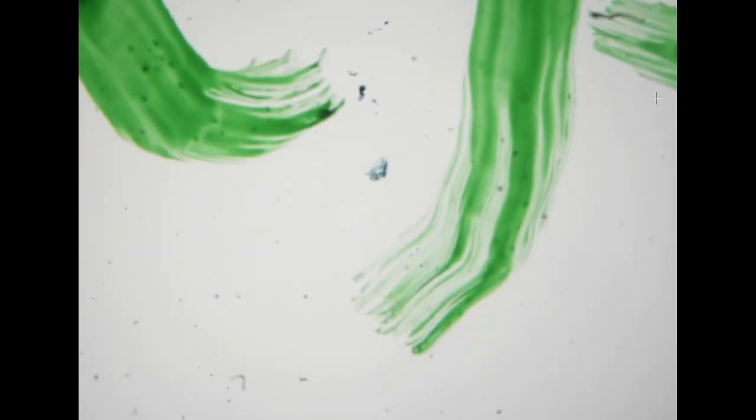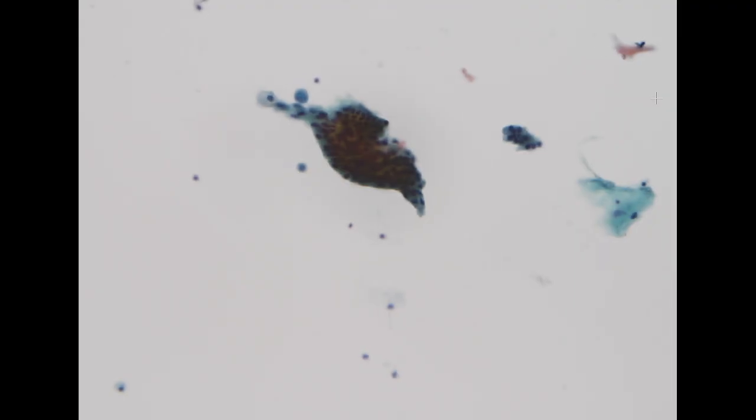So the next specimen is a new patient. He presented with some neurological symptoms and signs and was confirmed to have a brain tumor. And then the patient was also confirmed to have a history of lung cancer. So the brain tumor is likely metastatic from the lung primary. This is his CSF specimen.